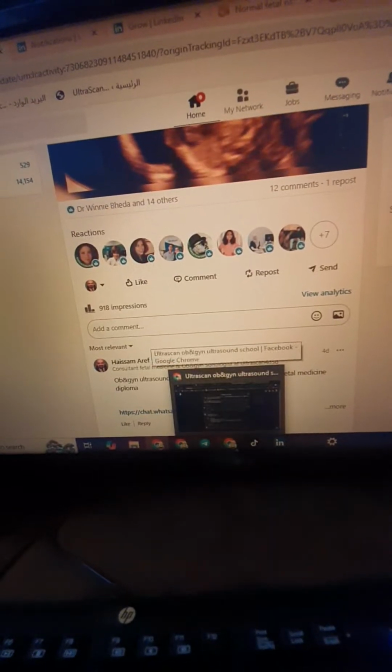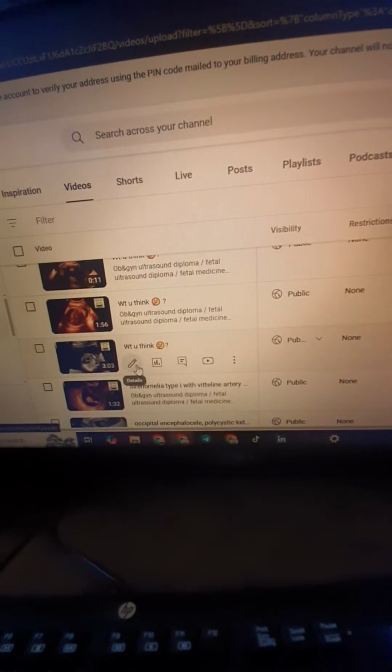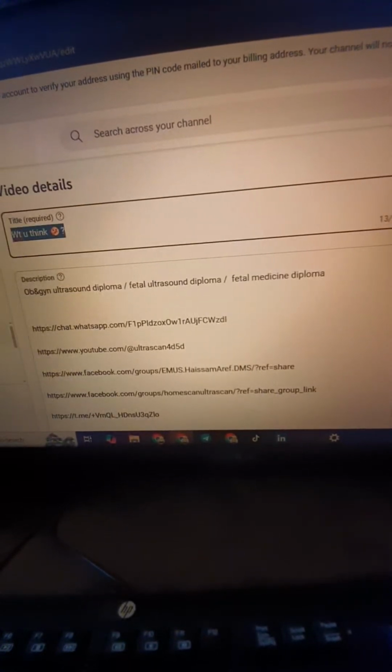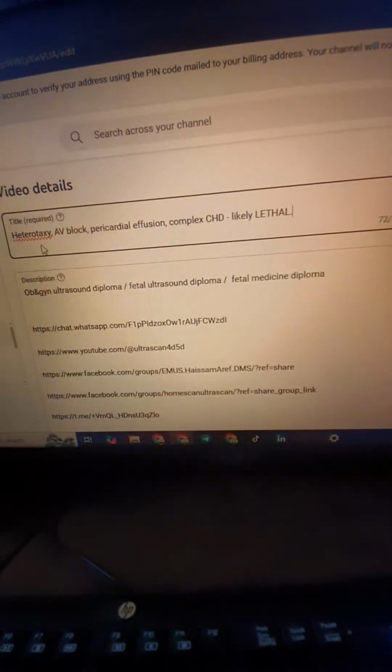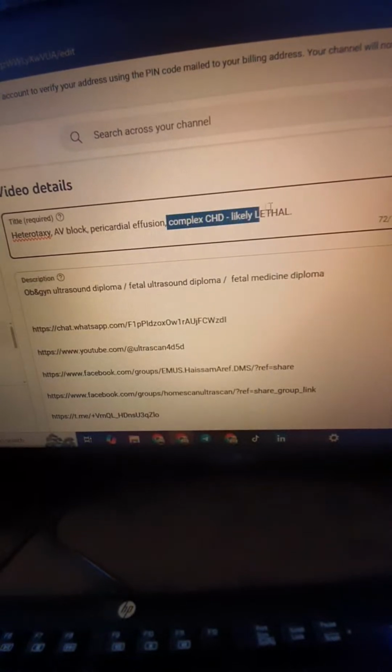So let's go to our YouTube channel and change it here. Yes. This case was very interesting: heterotaxy, AV block, complex congenital heart disease of double inlet left ventricle. Double inlet left ventricle, my friends.